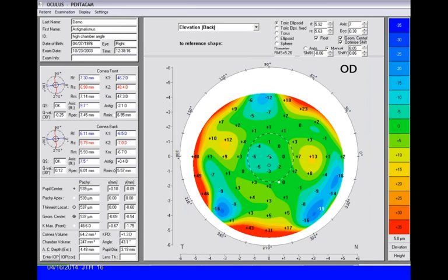On the back surface of this example, we see two little elevated areas that are just at the level of being suspicious, so we would look at that very closely. Now let's look at the maps for real patients. When we look at the top of this first patient's report, the K readings are pretty normal, the ratio is 81-82%—normal. The quality of the image is okay.